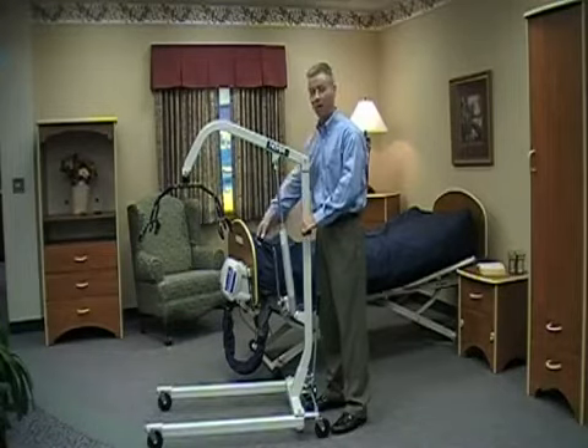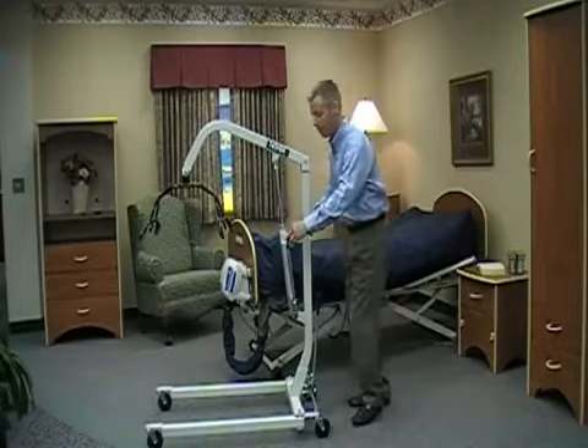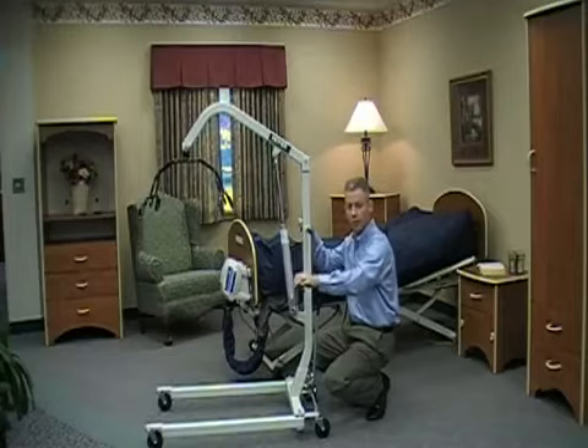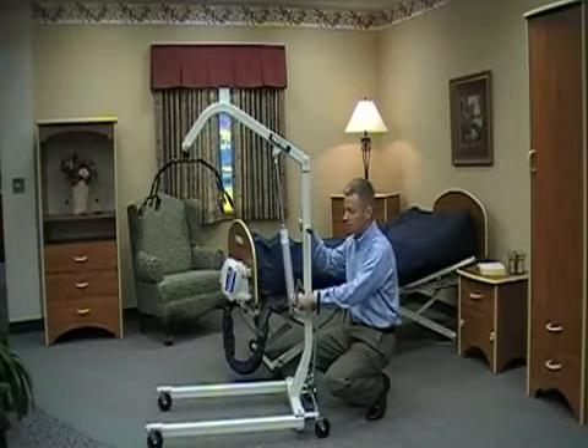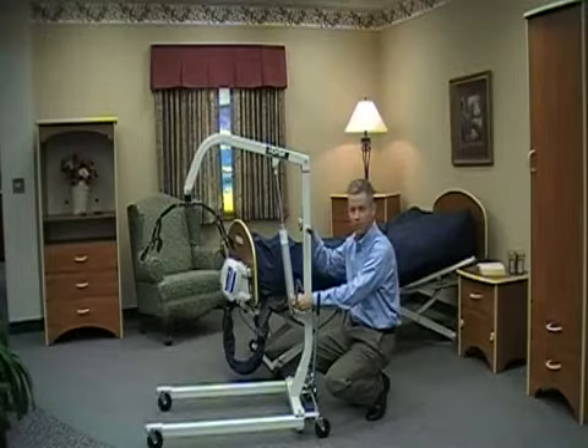We recommend that you have that in place prior to beginning the lift or transfer. That's simply operated by pushing down on that handle to raise, and then once you've got it to the correct position and are ready to lower, simply turning the dial to the lower position, then turning it back when you're done.